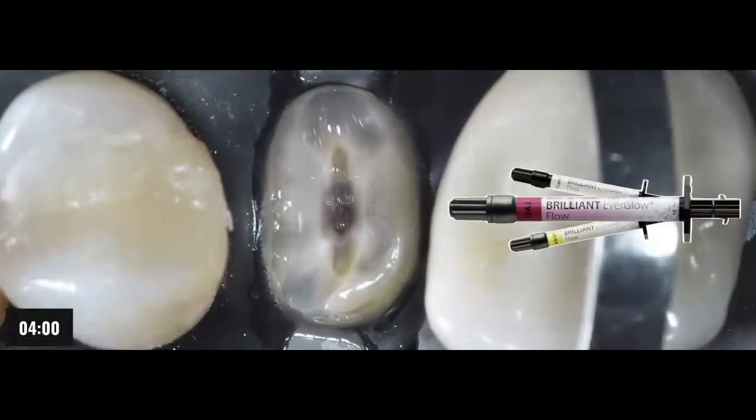I use Brilliant EverGlow Flow for my resin coating layer, and this is just a layer of flowable composite. You want to make sure that it's less than 1 millimeter thick, and the way that I recommend you check is to use a periodontal probe, sink it into your flowable composite, and make sure that you can see that 1 millimeter mark. It's telling you right there that you are less than 1 millimeter, and that's what you want to have. I apply that resin coating layer all over the dentin. Once I know that it's less than 1 millimeter thick, I light cure.